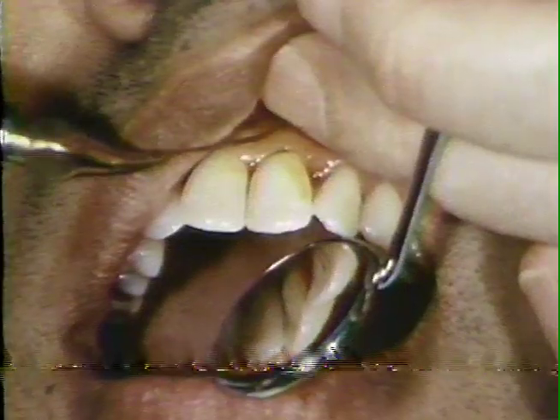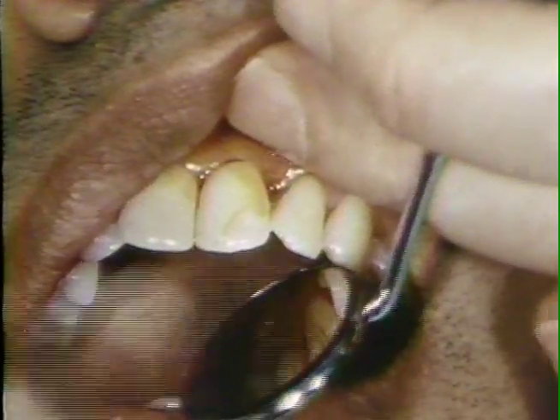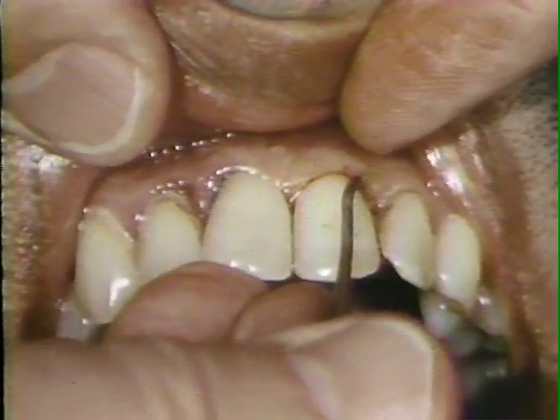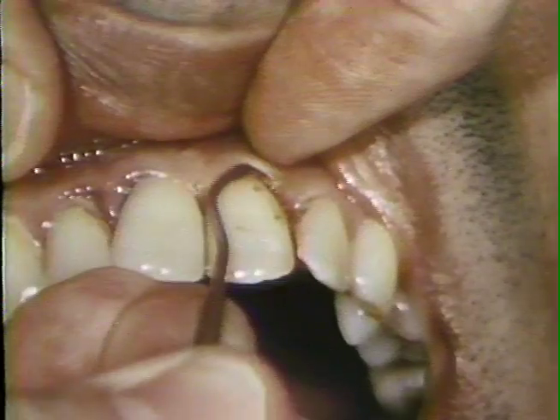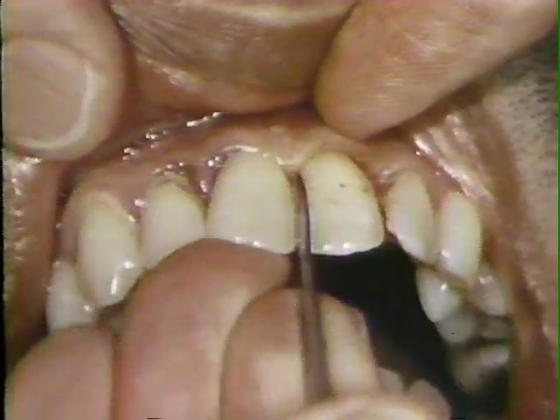First, the operative site is flooded with iodine lotion. A sickle scaler is used to remove the labial and interproximal calculus. Care must be observed to avoid forcing calculus into the supporting tissues.